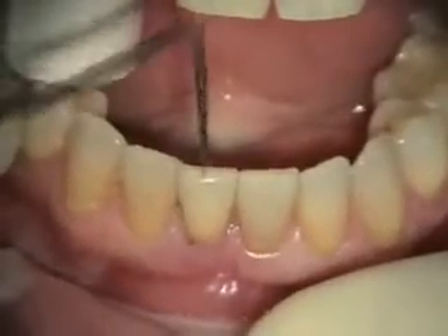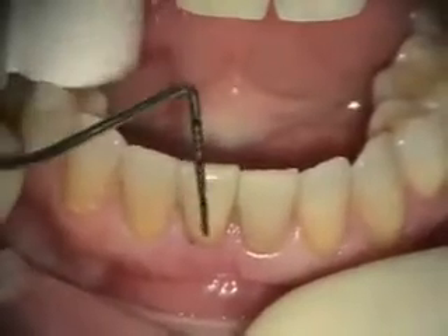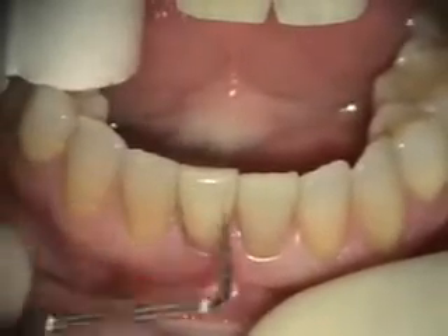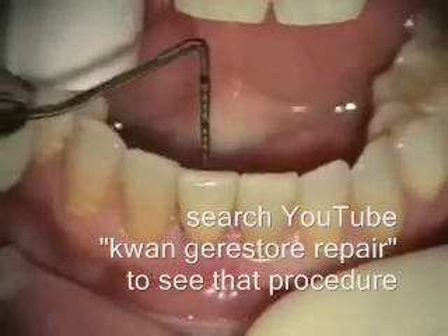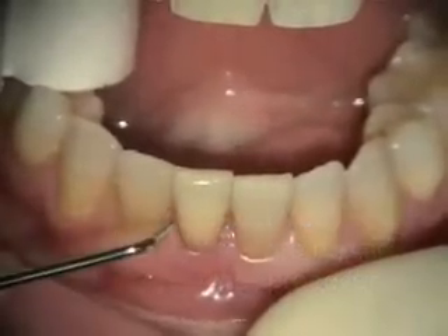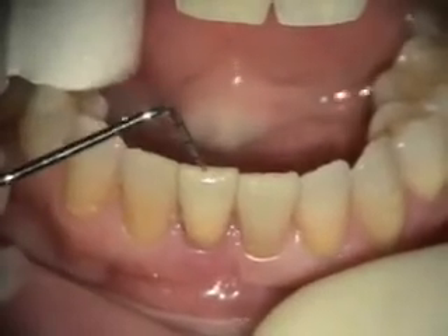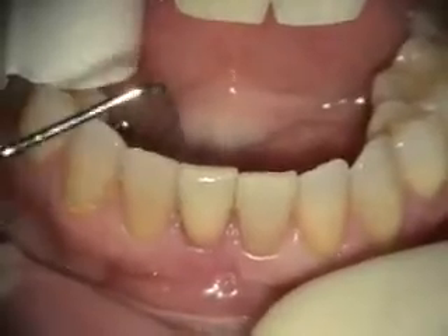Today we're going to be removing tooth number 25. Tooth 25 has some recurring infection on the lingual. Previously we had done a Gerostor repair, about over a year and a half ago, and it healed well, and then she ended up having an infection again. So we're going to be taking this tooth out, bone grafting the socket, giving her a stay plate, and then we'll be prepping this site for an implant later.